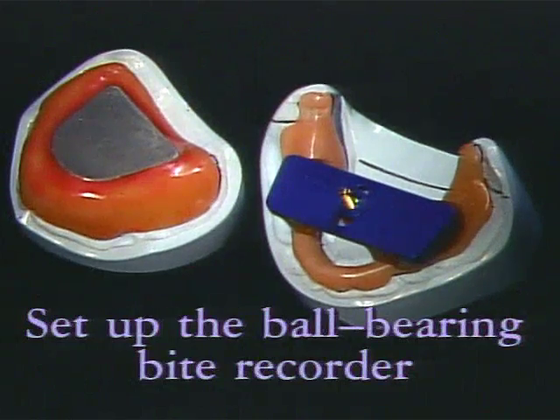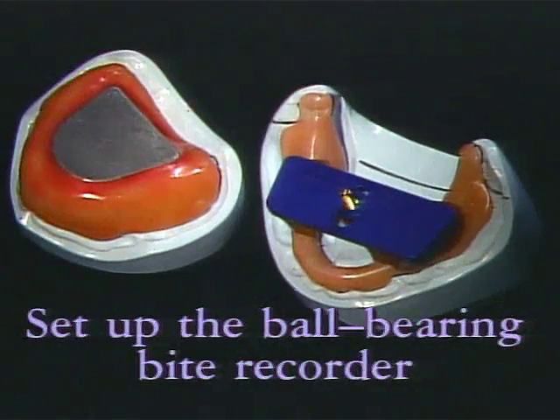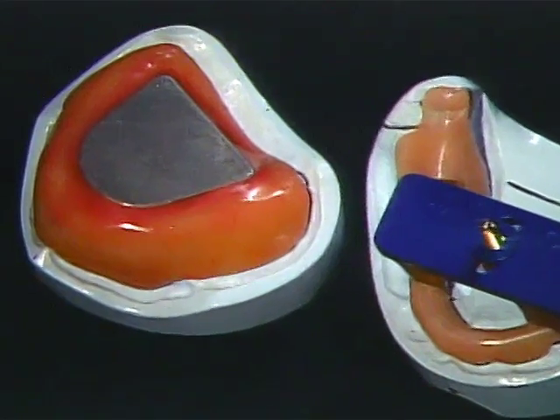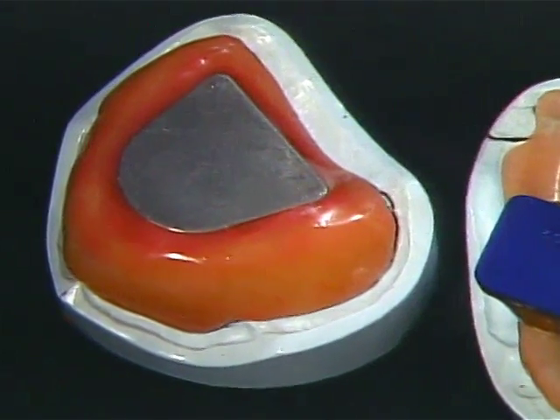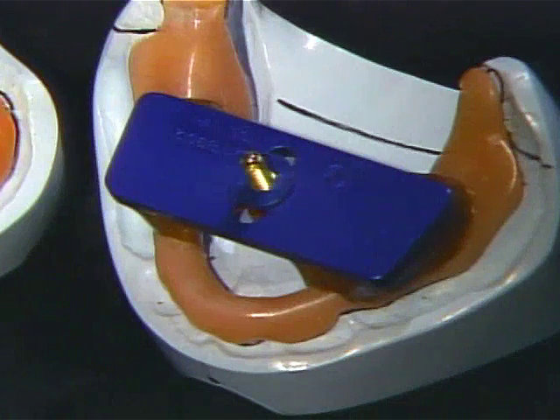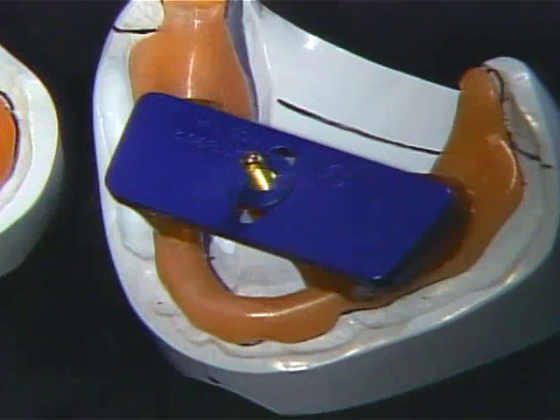The ball bearing bite recorder is a device for making very accurate recordings of jaw relationships. The upper base plate has a flat metal striking plate in the palate. The lower base plate carries the adjustable ball bearing marker. The ball bearing bite recorder records only jaw relationships.